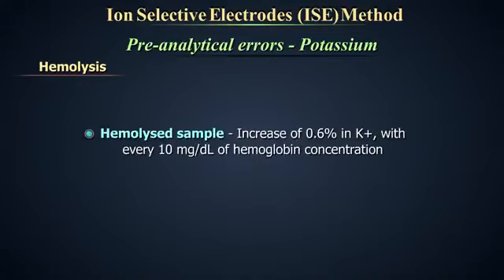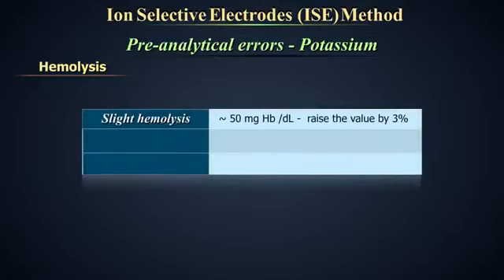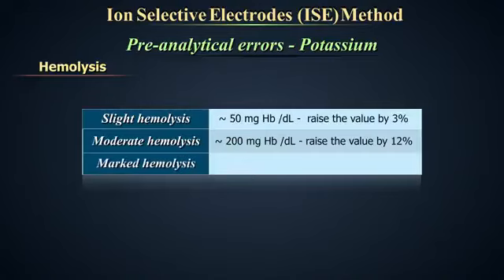Hemolysis. If the sample is hemolyzed, an increase of 0.6% in potassium with every 10 mg per deciliter of hemoglobin concentration can be expected. Thus, slight hemolysis, approximately 50 mg hemoglobin per deciliter, can raise the value by 3%. Moderate hemolysis, approximately 200 mg hemoglobin per deciliter, can raise the value by 12%. Marked hemolysis, that is, greater than 500 mg hemoglobin per deciliter, can raise the value by 30%.